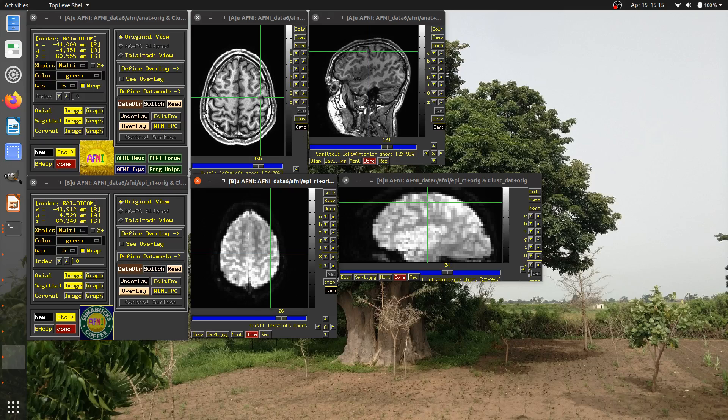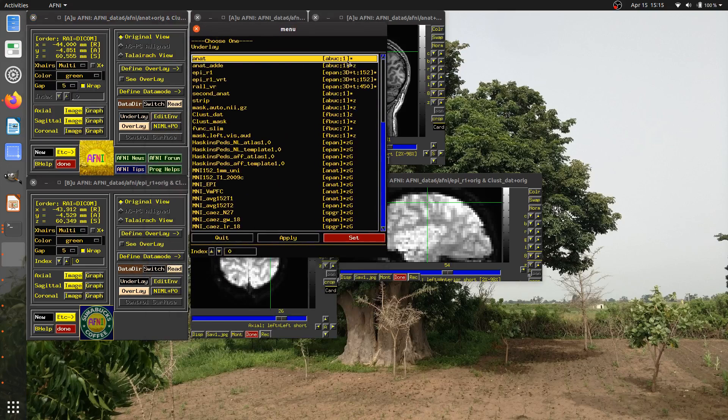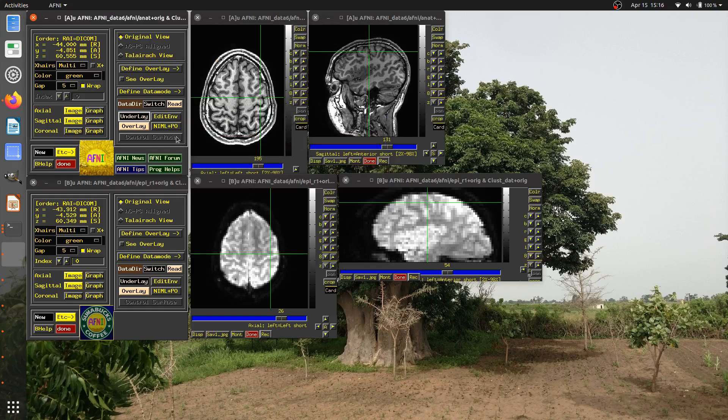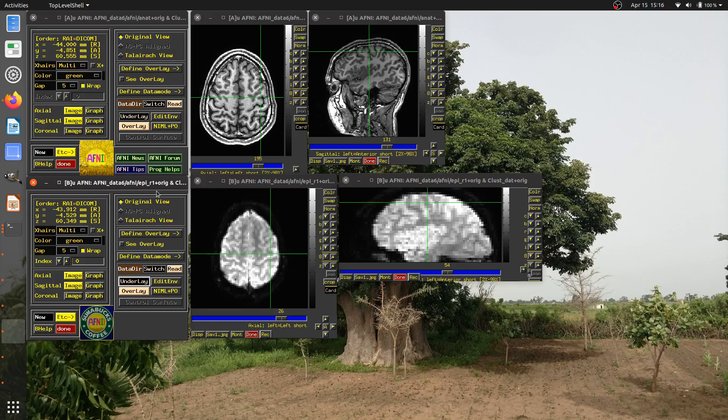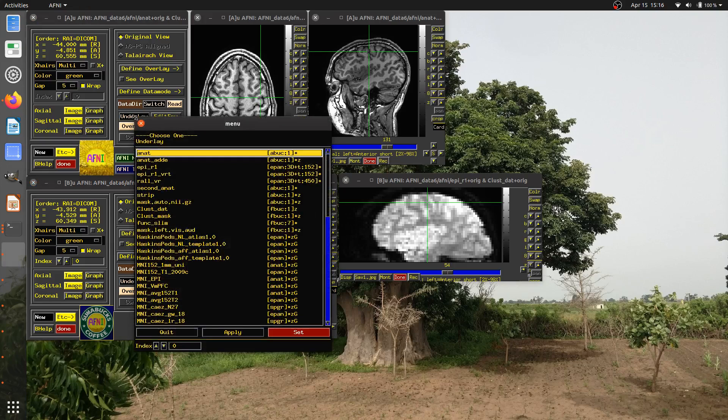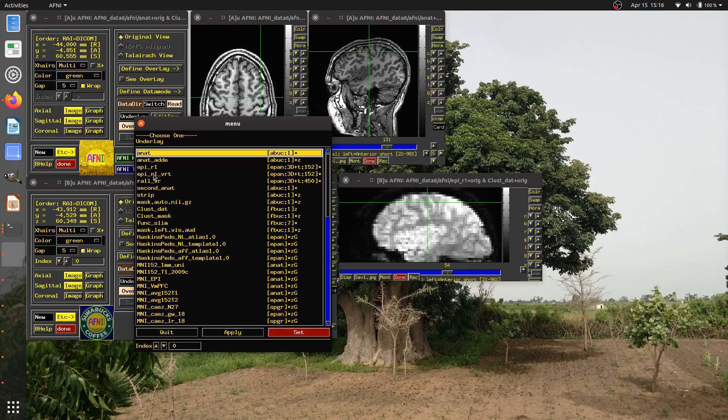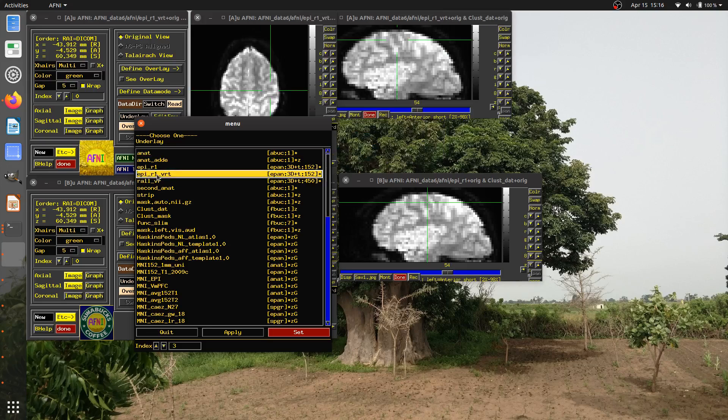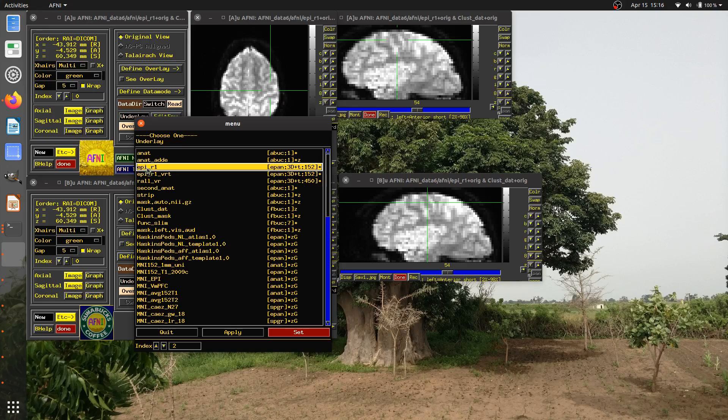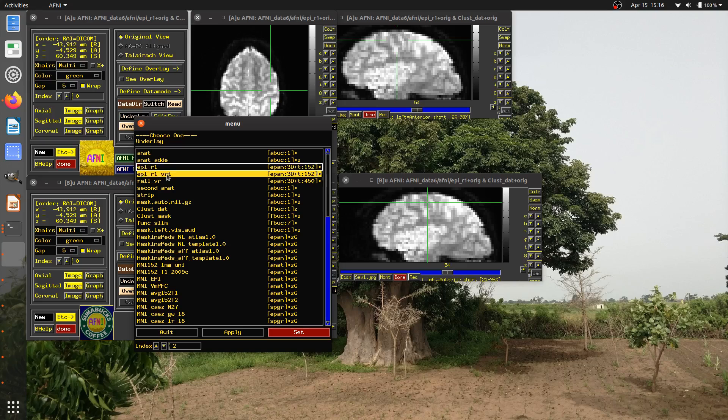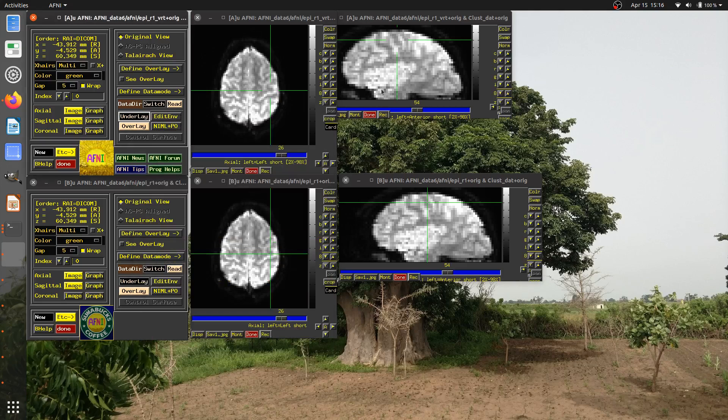Now, this dataset here, if I look at the underlay, it only has a single time value. It doesn't have, like this dataset here is 3D plus T, and it has 152. So if we want to discuss how things are locked together in time, what I'm going to do is I'm going to change this anatomical dataset, the underlay, and I'm going to choose it to be this EPIR1 underscore VRT. This also has 152 time points.